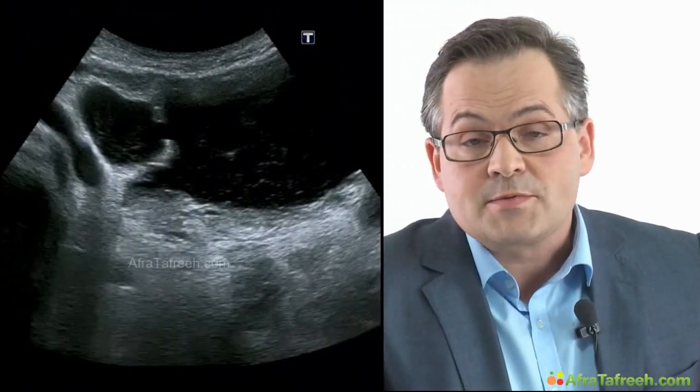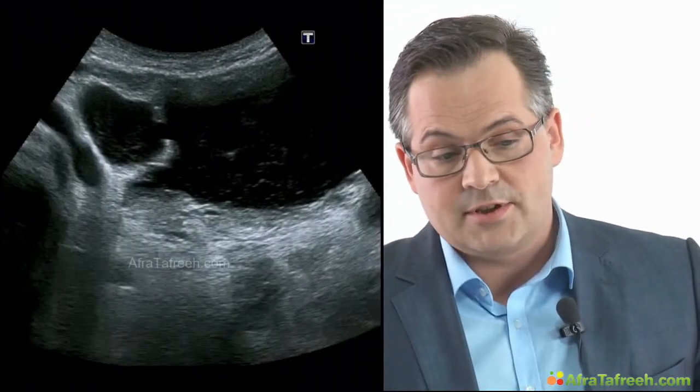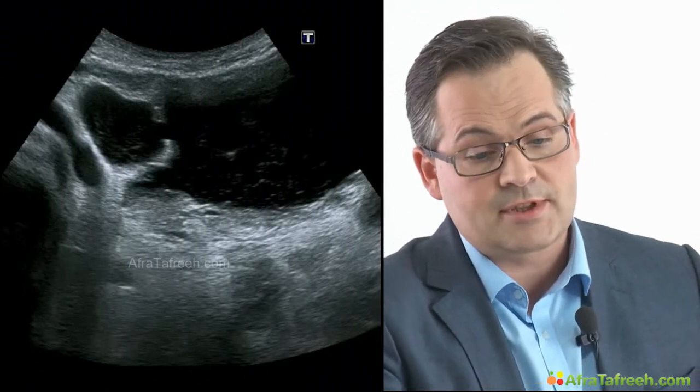Now, what can you learn from this case? Sonography is a very helpful tool to detect if a urinary bladder is full. And you can also see the cause of it, like in this case, even if it's a dislocation of a urinary catheter. And you can relieve the patient's pain immediately. Totally correct. The only question was, is the bladder full or is it empty? And is the balloon there or not? Of course, we can see a lot of other things like diverticula over here and the enlarged prostate. But these issues will be mentioned in the following chapters.